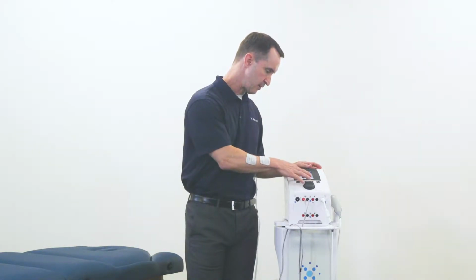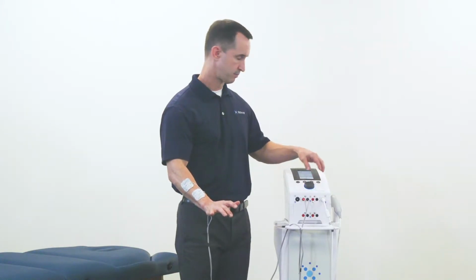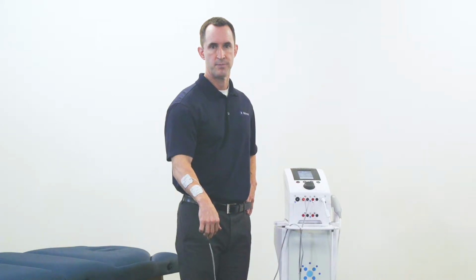So if I highlight my amplitude and increase my intensity, we'll take this up to maximum contraction and then start the treatment. Now we'll go into full contraction for 5 seconds, and then it'll rest in an off period for 5 seconds with a 2-second ramp time.